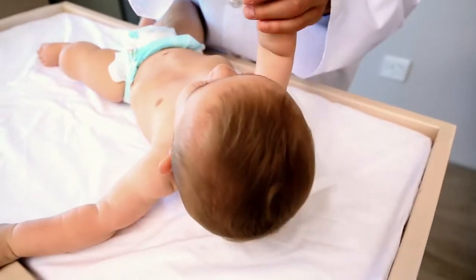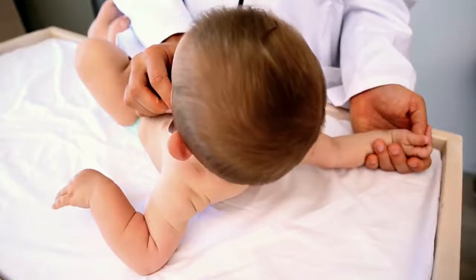For centuries, clinicians have touched lives with the help of a trusted companion, the stethoscope.